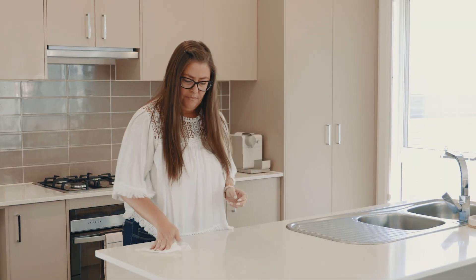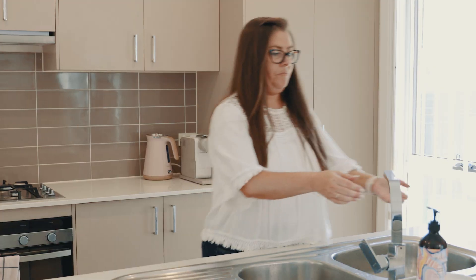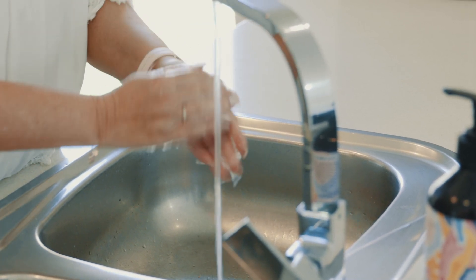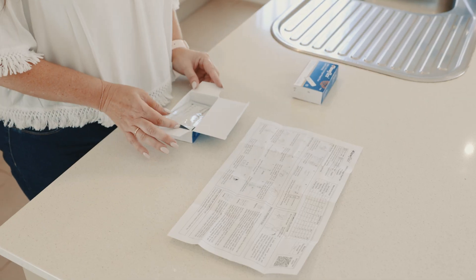Testing for COVID-19 is simple. Start with a clean and tidy surface and wash your hands thoroughly. Open your FlowFlex Rapid self-test kit and check that you have everything.